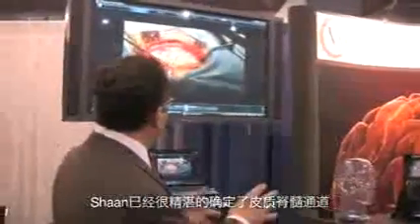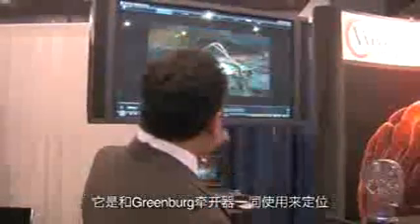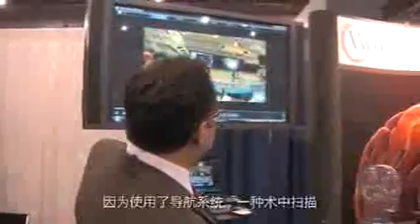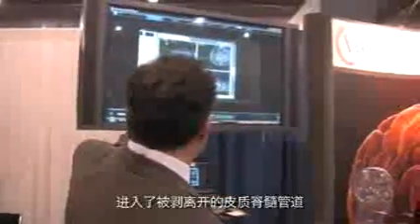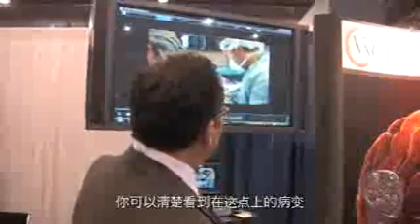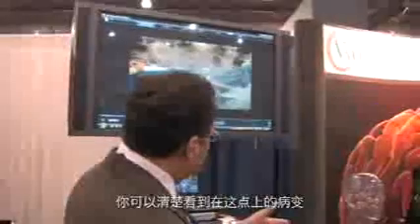Sean has been doing wonderful work identifying the corticospinal tracts to try to make dissections through that, getting in. This is the actual system that I've been using. It's just a Greenberg retractor to hold this in place. That is the actual holder. And we use the navigation system. This is the intraoperative suite scan. You can see going after the lesion at this point with another one of our residents, using the navigation system to just go ahead and dissect the tract.